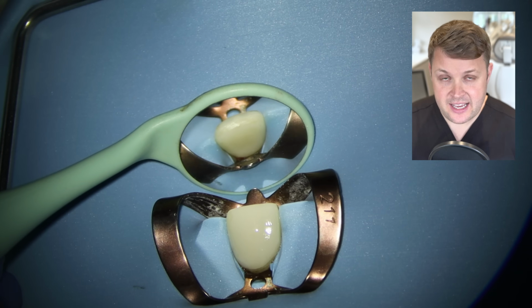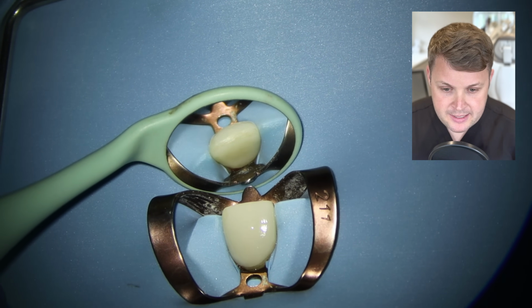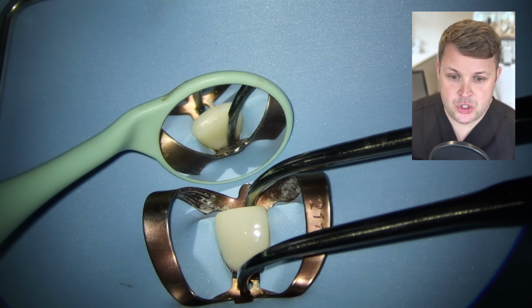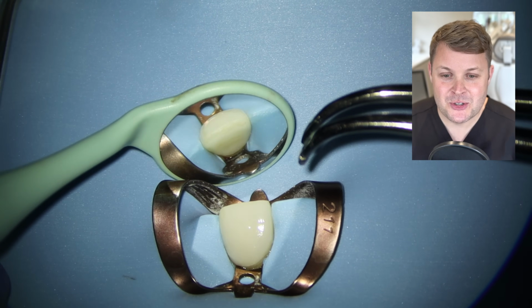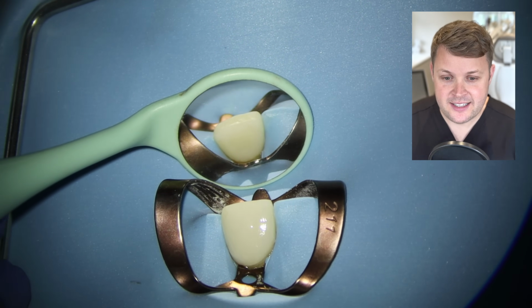So in this case, with this tooth, I am going to place rubber dam on straight away. And then when we put the clamp on here, I notice that the clamp is sitting a little bit too buccally, so I just need to adjust this so I've got a little bit more access, and also I give it a little bit of a wiggle so the rubber dam reaches underneath the clamp and gives us that nice tight seal.